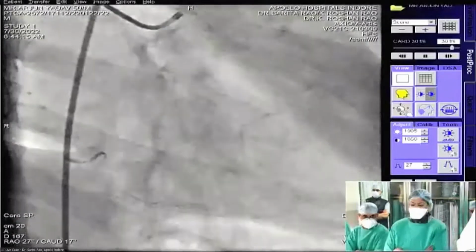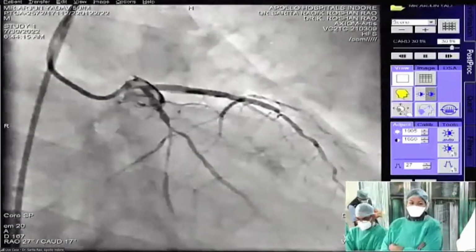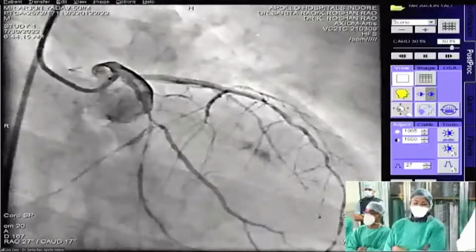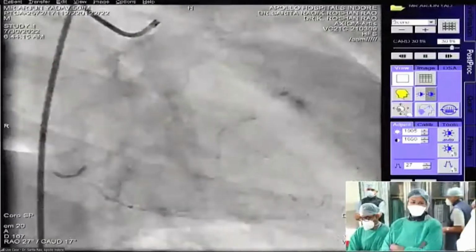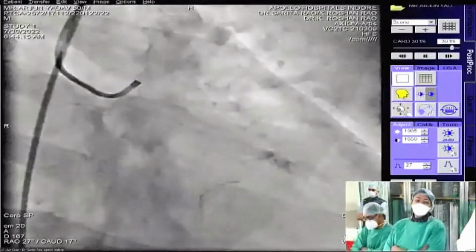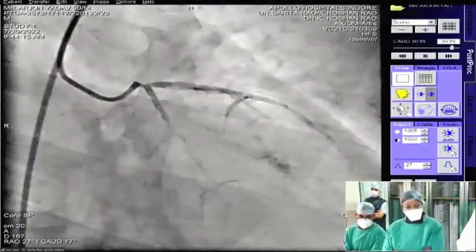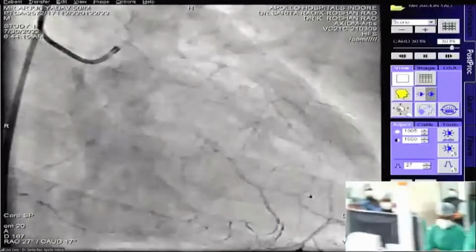Okay. So thank you for all the lovely comments, and we really appreciate it. Now, the ejection fraction looks a little better because right now he's on a 10 mics dose of adrenaline. Second is whether I'm willing to take the risk. This patient actually has no other choice. You see, he's a surgical reject. He's been to several surgeons. The risk factor was too high for him. He's having resting angina. Does he really have any other choice with this angiogram, except that a cardiologist like you would take him up and relieve him? So yes, I'm willing to take the risk because this patient has no other choice.